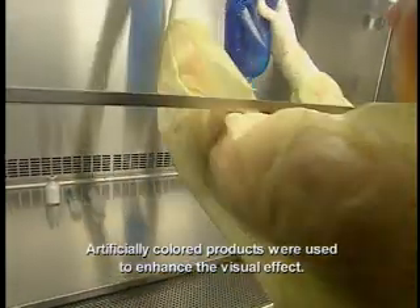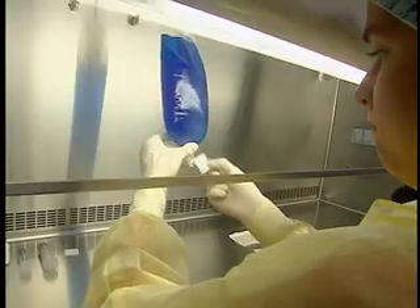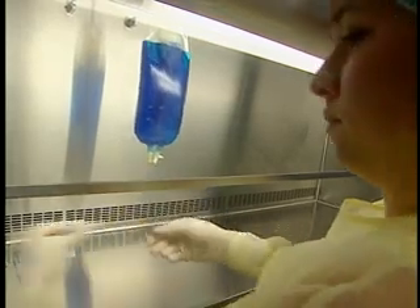Hang the solution bag in the center of the hood. Disinfect the injection port with an alcohol swab and let it dry. Discard the swab on the side of the hood with the non-sharp waste.